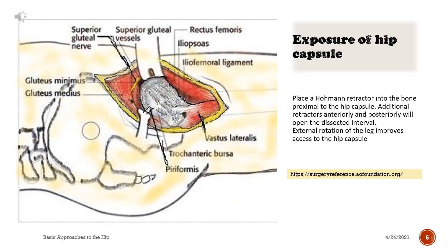Exposure of hip capsule. Place a Hohmann retractor into the bone proximal to the hip capsule. Additional retractors anteriorly and posteriorly will open the dissected interval. External rotation of the leg improves access to the hip capsule.